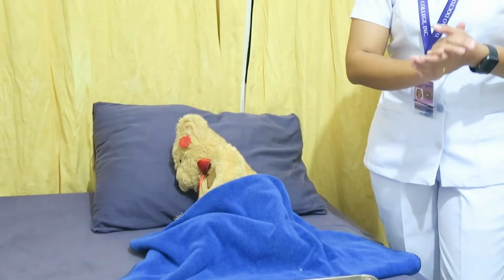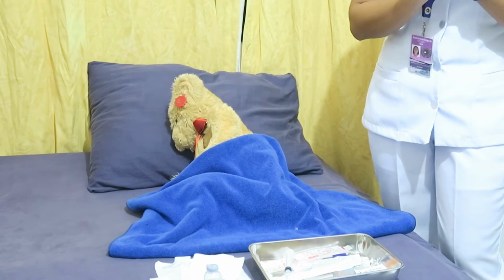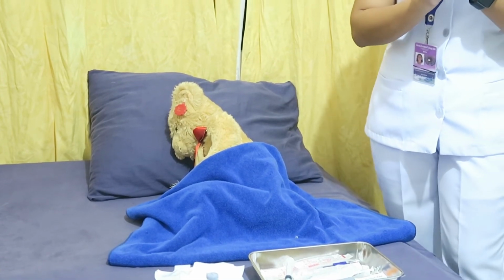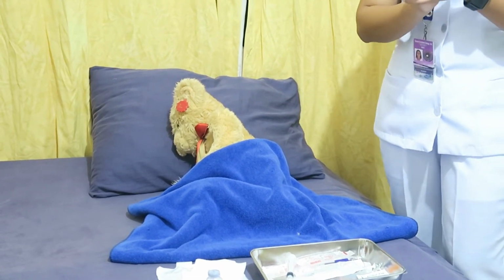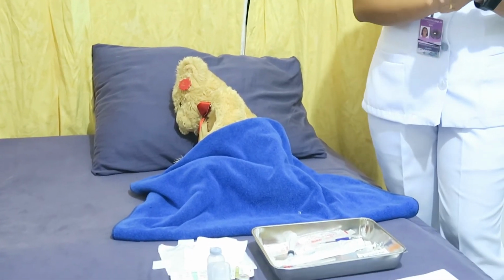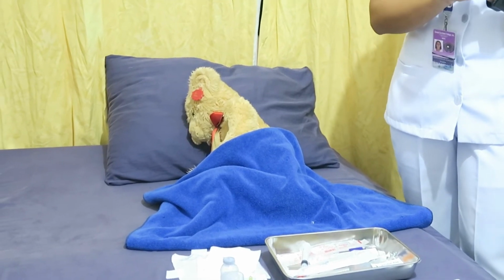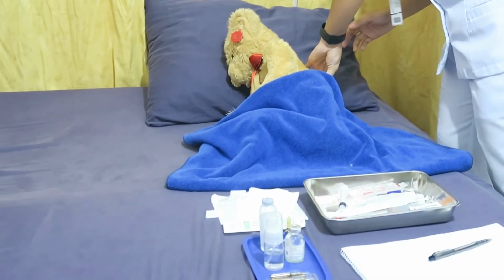Then after that, transfer and hold the swab between the third and fourth fingers of your non-dominant hand in readiness for needle withdrawal, or position the swab on the client's skin above the intended site. The rationale for that is that this will help reduce the discomfort of the injection.